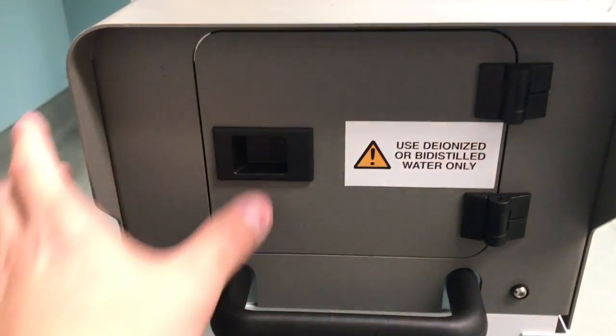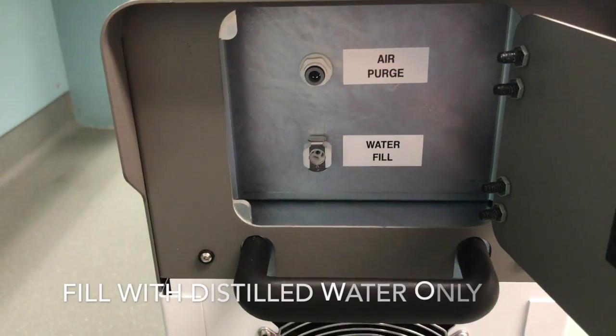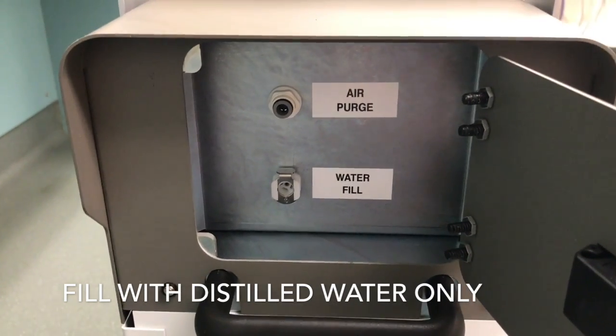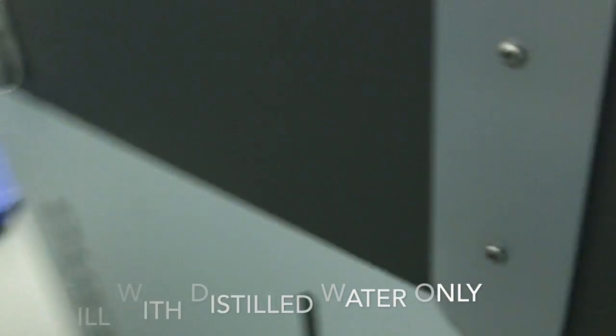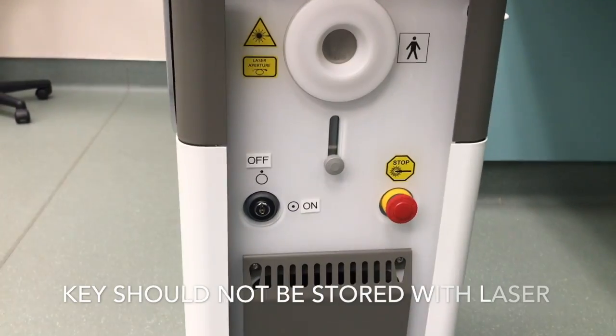On the back we also have a door that allows you to fill the laser with water — this is distilled water. On the side of the laser we have a window that allows you to see the water level. When it turns on, it does light up.